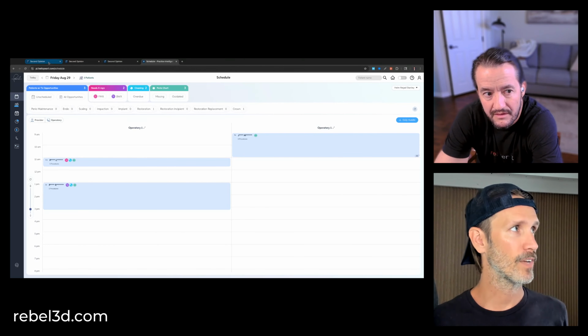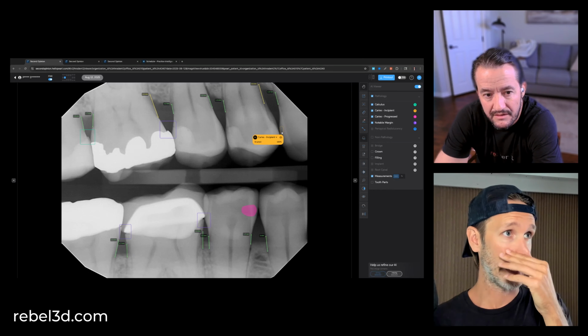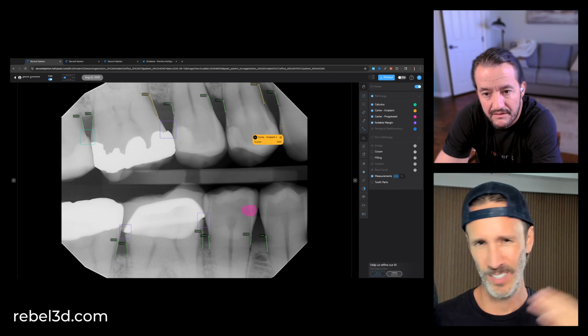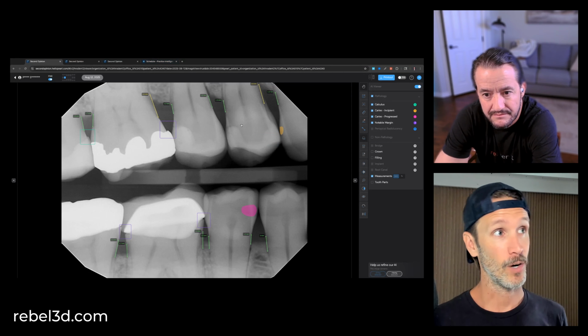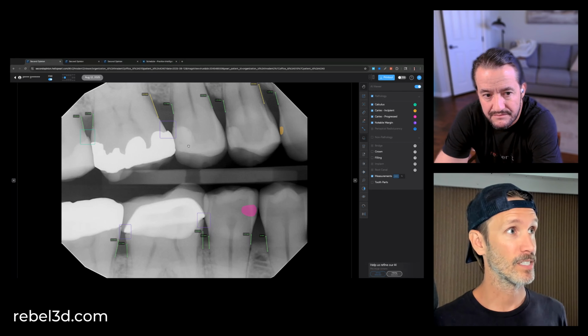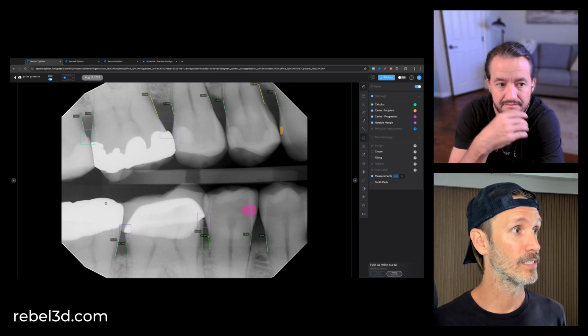Like in that specific case, you may say, oh no, I'm just going to watch this. This is still in enamel. I know this patient, they're fine. I'm just going to watch that. Or you look at all these other fillings they've had and go, ooh, gosh, they're caries prone.